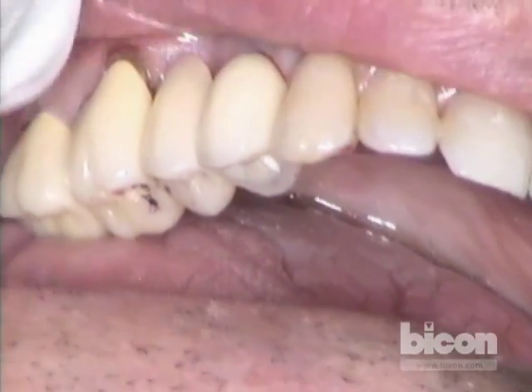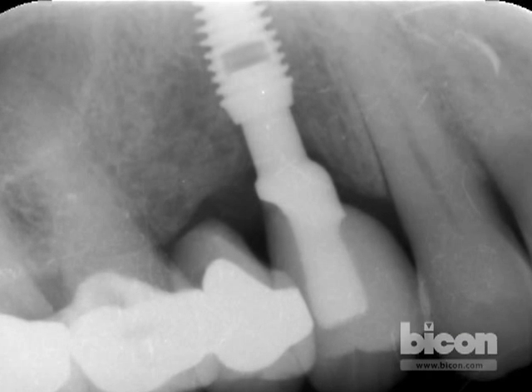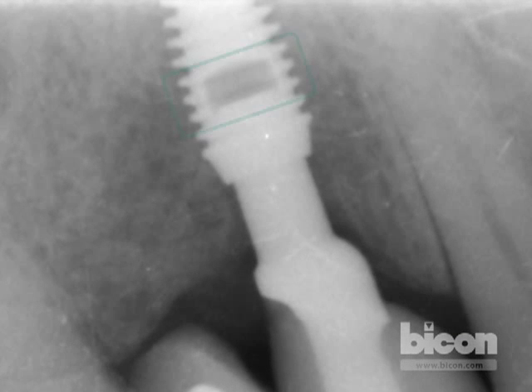This is all set — we're going to take a radiograph. I know that the crown is inserted all the way down because there are two threads of the implant left, two threads of space left at the end of the well. It tells me that within a framework, this is definitely seated down.